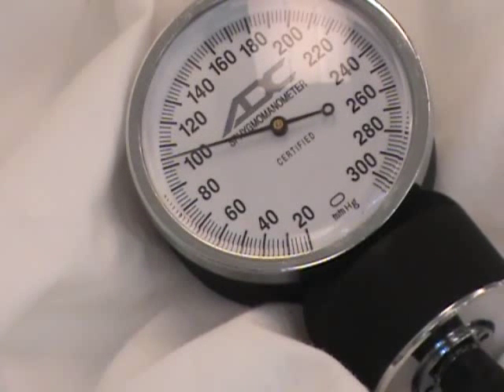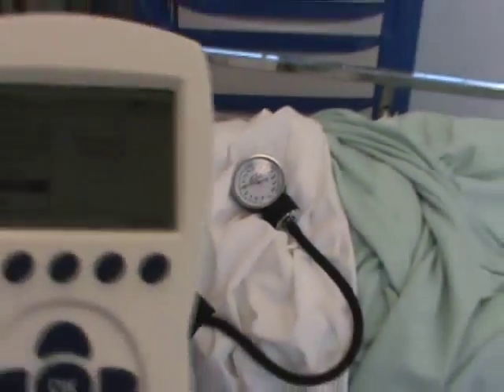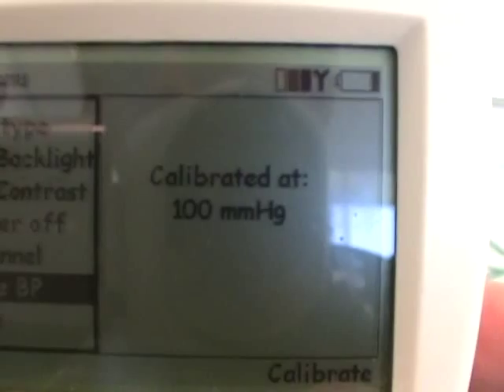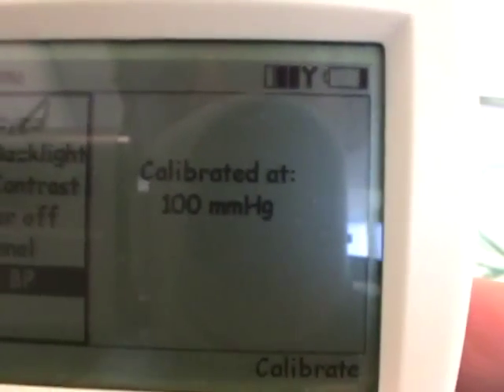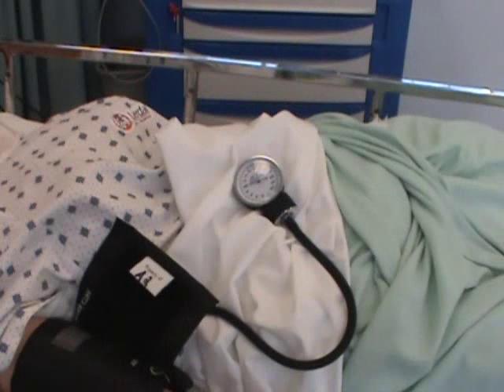Give it a little more air. That's pretty close to 100 right there. Let's see if it's happy with this. Coming back to the calibrate button — press that. And it says calibrated at 100 millimeters of mercury. Now we've calibrated the BP cuff and we're ready to use the VitalSynth.